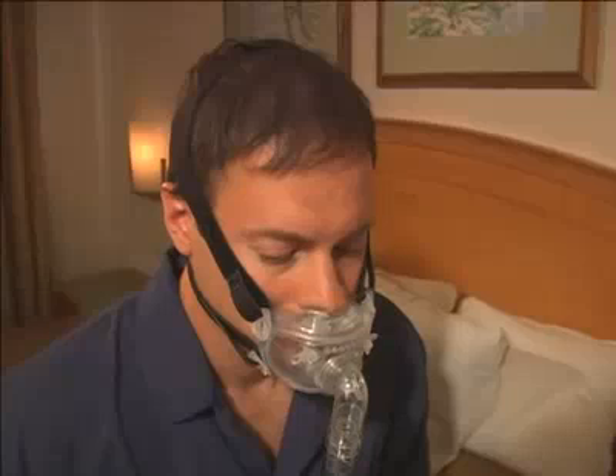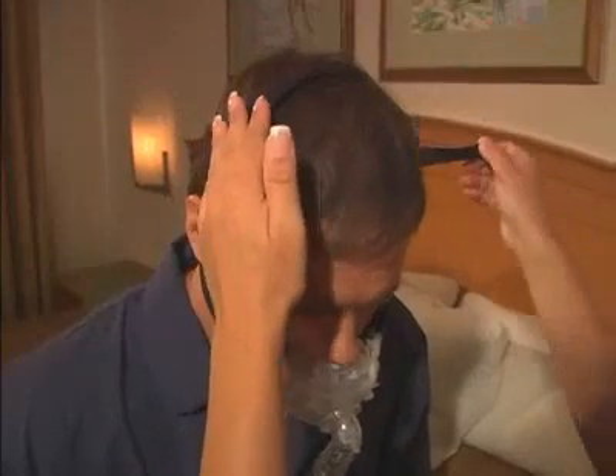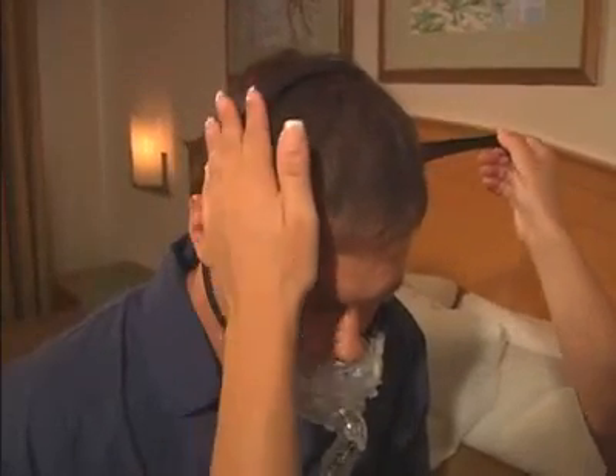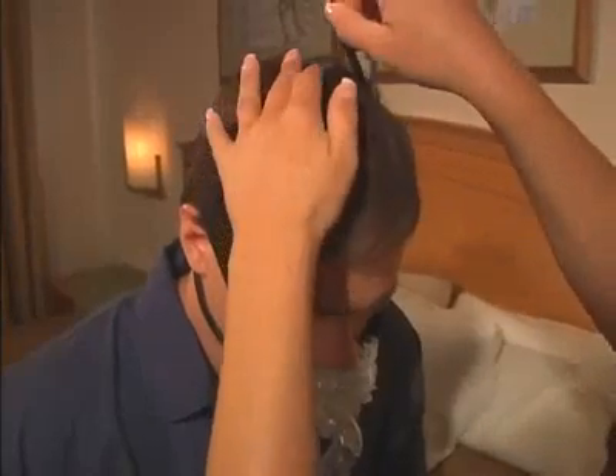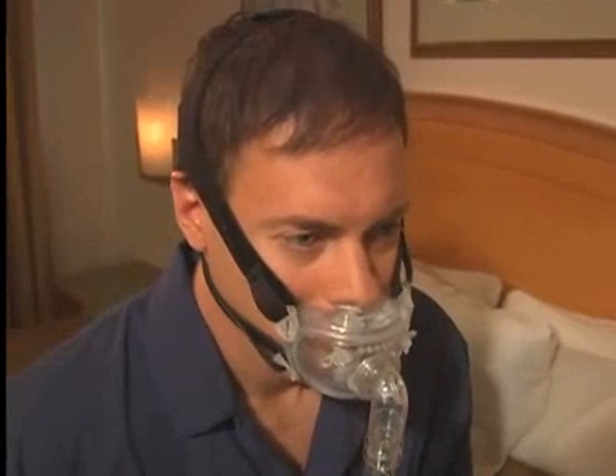Additionally, it is important to adjust the fifth headgear strap that is positioned on top of the patient's head. Adjust this overhead strap until the pillows fit comfortably against the nose. Adjusting the overhead strap also ensures that the other four straps are not on the ears.